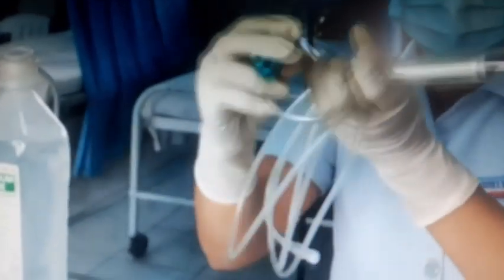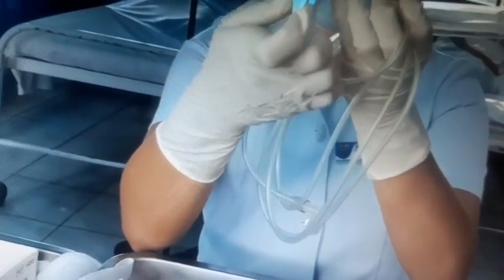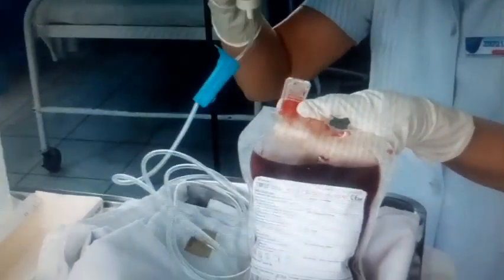Wash hands and observe appropriate infection control procedures. Prepare the infusion equipment. Prepare the blood bag. Don gloves. Insert the piercing pin into the port of the blood bag. Fill the drip chamber at least half full. Hang the bag. Prime the tubing. Remove air bubbles. Disinfect the Y port of the IV tubing and insert the needle from the BT administration set and secure with adhesive tape.